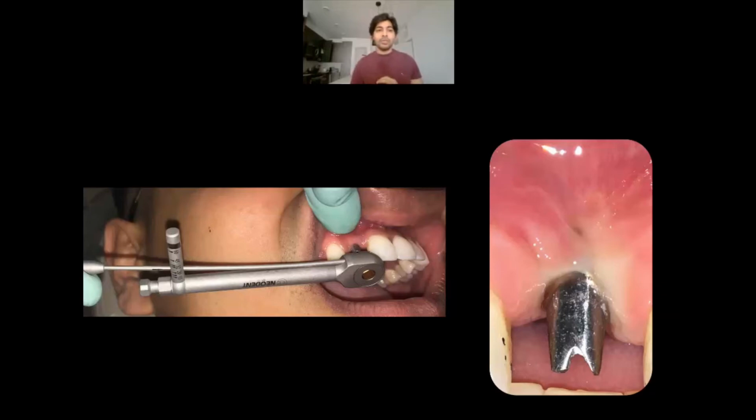In this case, I used a Straumann Neodent implant. The recommended torque value for the Neodent implant is 15 to 20 Newton centimeters. After torquing it down to the recommended torque value, you can see in the right side picture the blanching of the gum tissue. That is pretty common, very common. If you wait 10 to 15 minutes, the blanching will go away.